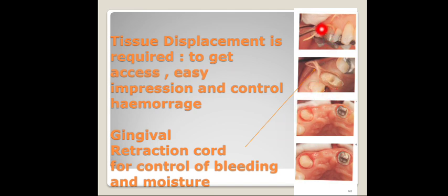This displacement of gingiva is divided into three ways. Maybe mechanical, maybe chemical, and maybe chemomechanical. It means the mixing of two techniques. The mechanical separation is made by retraction cords. The retraction cords are large size cords, which can be placed for a while before taking the impression.